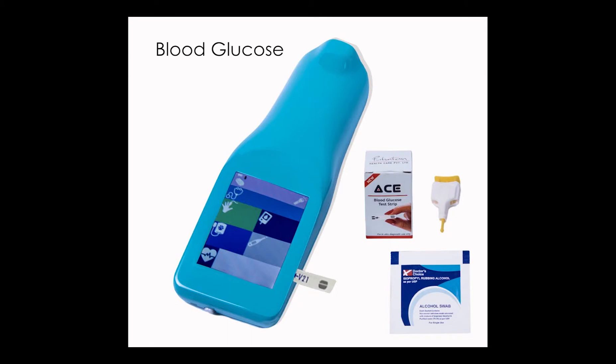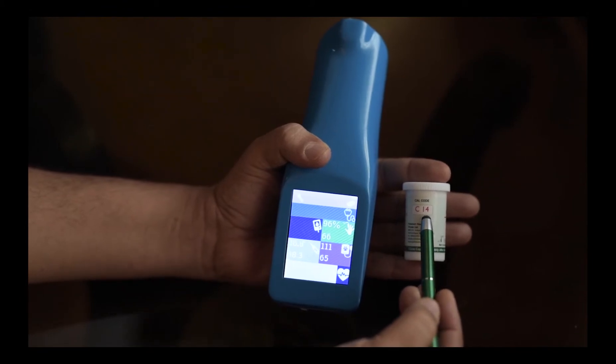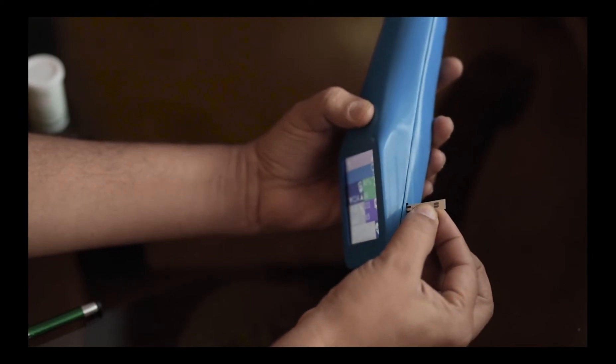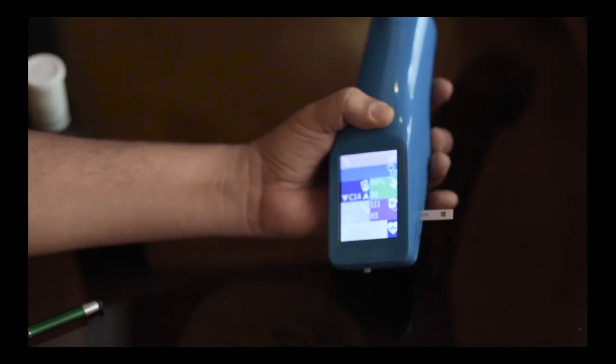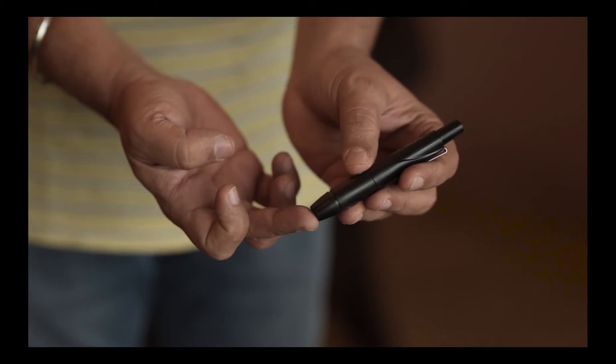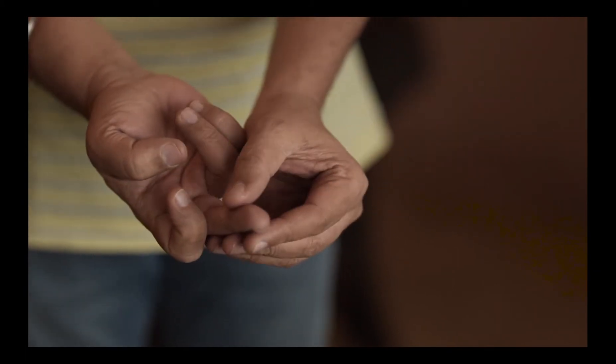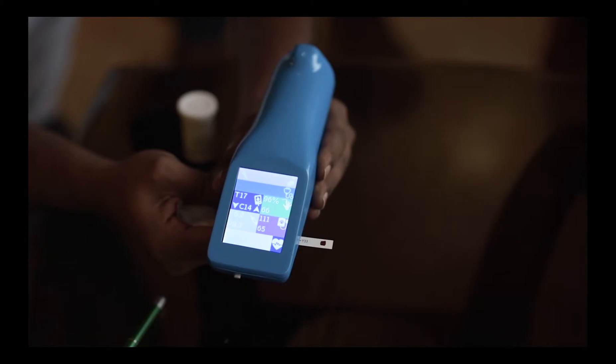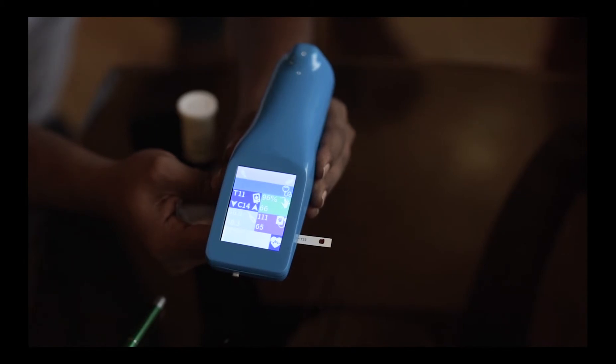We shall now measure blood glucose of the patient. Blood glucose is measured using strips having a batch number. The batch number needs to align at the device. Once the batch number is aligned, we pull out a strip inserted in the required slot. A blood sample is drawn. The drop of blood is then placed in the required area on the strip to measure the blood glucose. It takes a cycle of 20 seconds to read off the blood glucose levels of the patient.